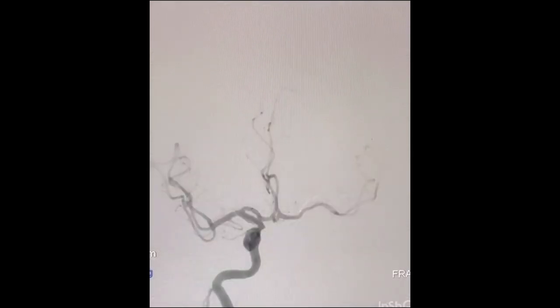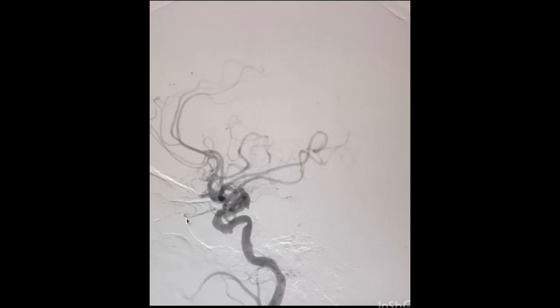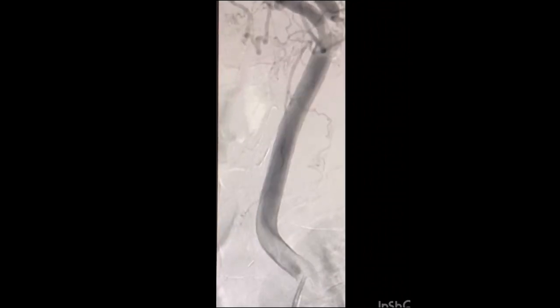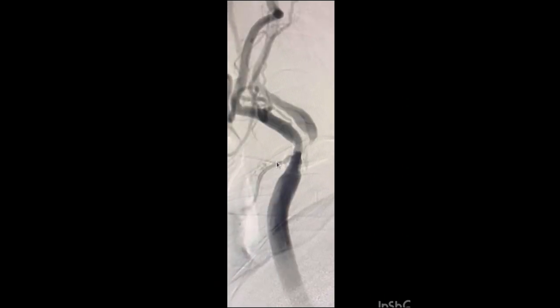This patient had a tight left ICA origin stenosis. As noticed here, there was a good ACOM collateral. There was near concentric calcific stenosis involving the left ICA origin. Beyond the stenosis, the ICA was angulated and had a tortuous course.